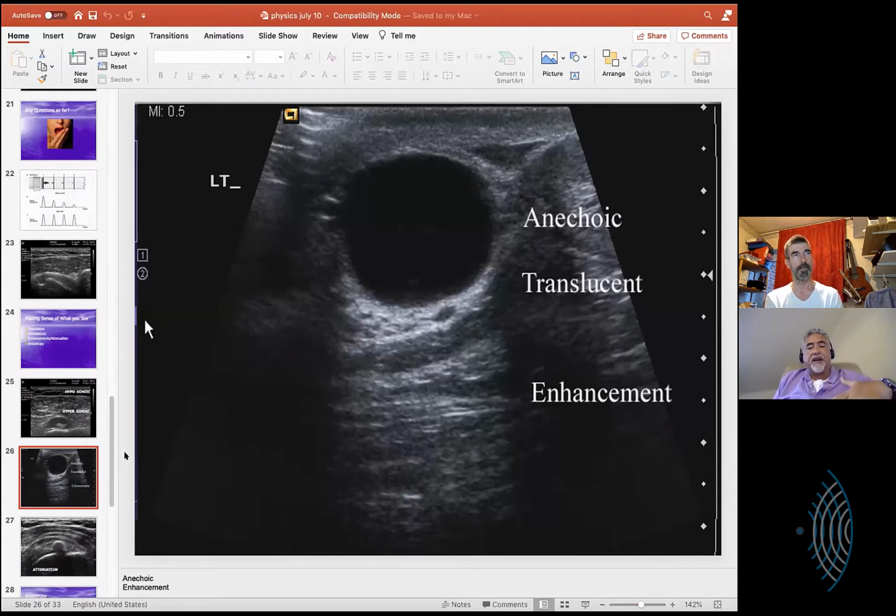It was expecting to go through denser material, so it heightened the location of what it is by turning up the volume. Yeah. So this is normal tissue just around a testicle, coming down here, and you can see it's just a very bland grey, and then suddenly this stuff behind the cyst, and this is an epididymal cyst, has just got really bright behind there.